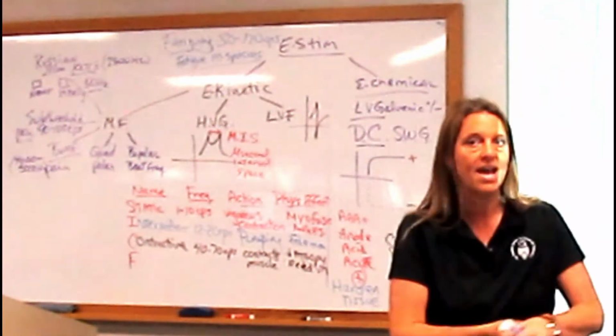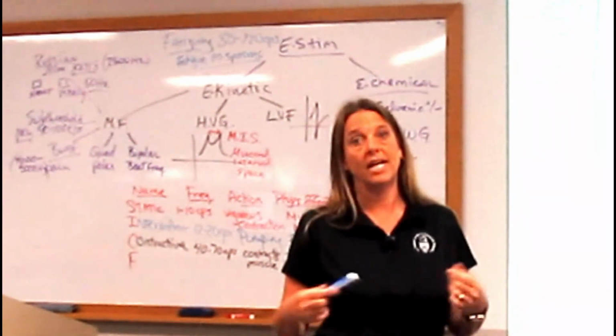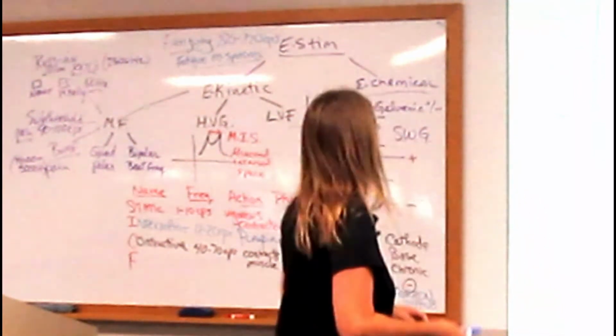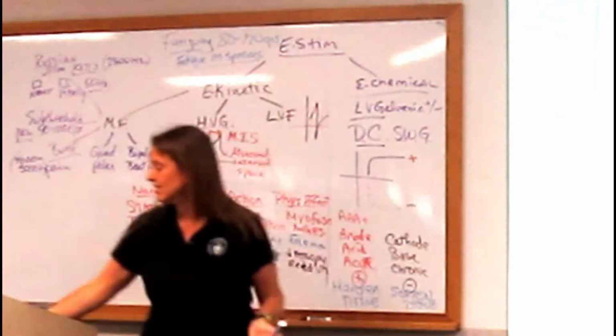So this is called the sweep phenomenon for frequency. So you sweep fast or sweep slow, and that's going to prevent accommodation or getting used to the sensation, the speed of the frequency. The last thing to talk about, what size pad do you use? So back to that previous slide.